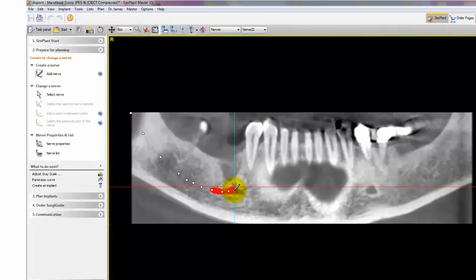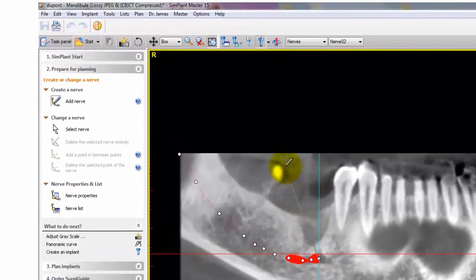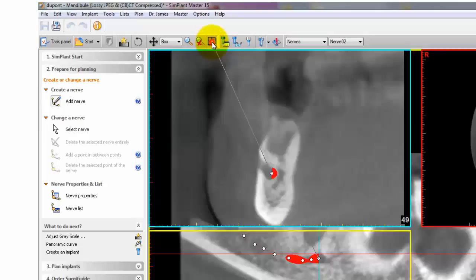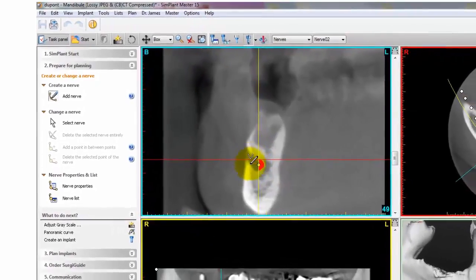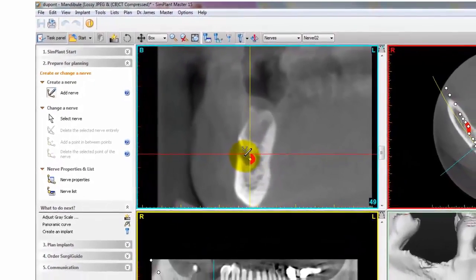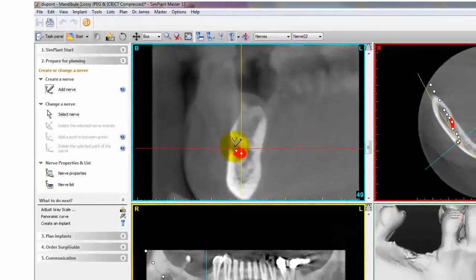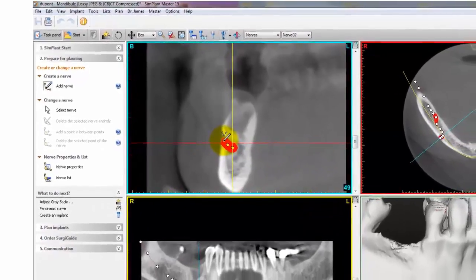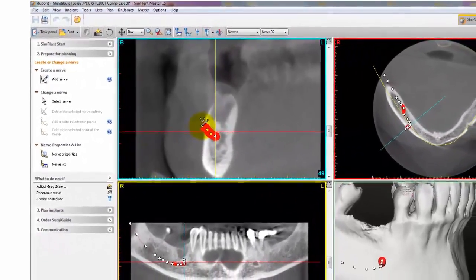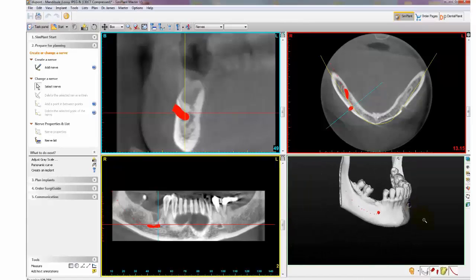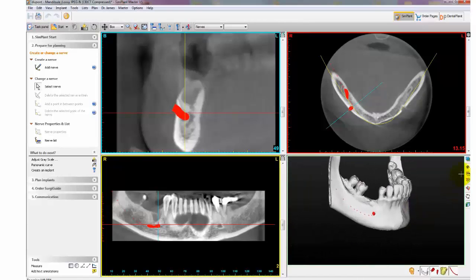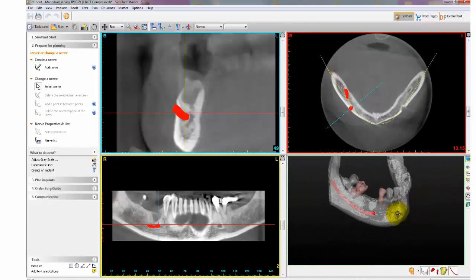Select the Zoom to Fullscreen tab and finish the anterior loop within the cross-sectional view. Finish the nerve by double clicking. Once you're done drawing the nerve, you can view it within all four panes.